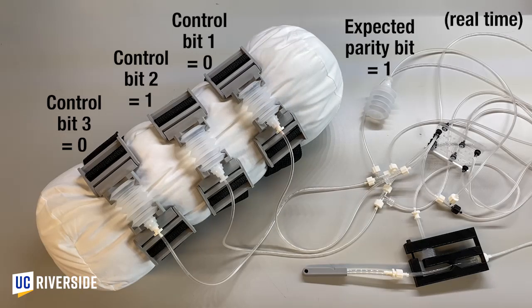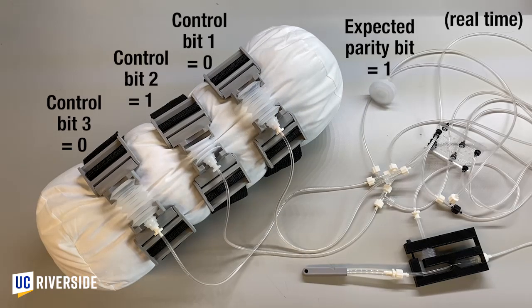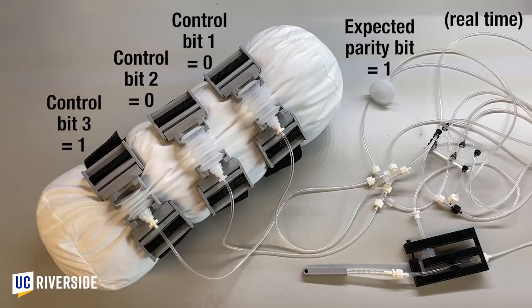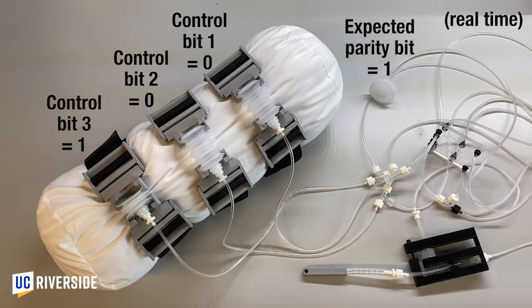When control bit 2 is under vacuum, there's still an odd number of control bits under vacuum, so the expected parity bit is again 1, or under vacuum. Finally, when control bit 3 is under vacuum, the expected parity bit is 1 once more.